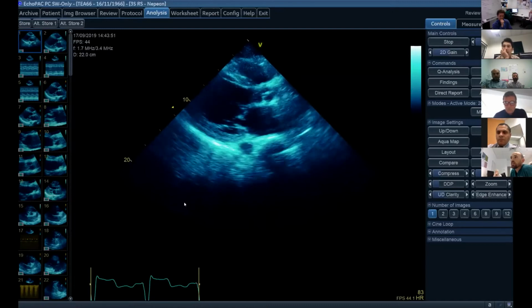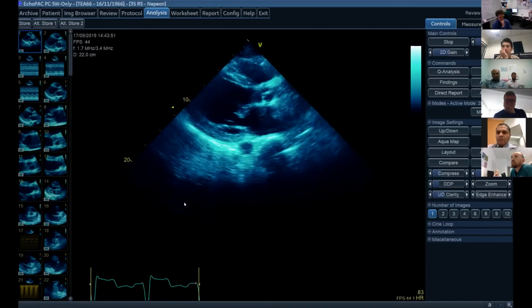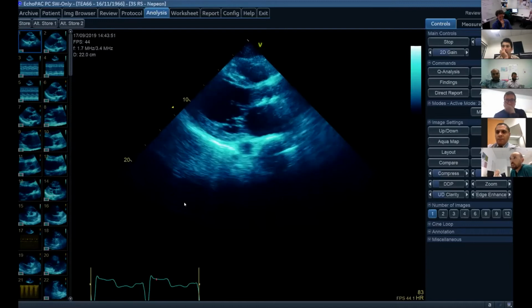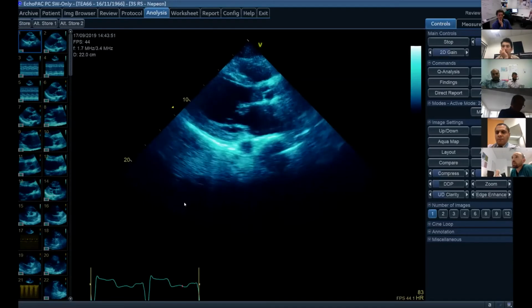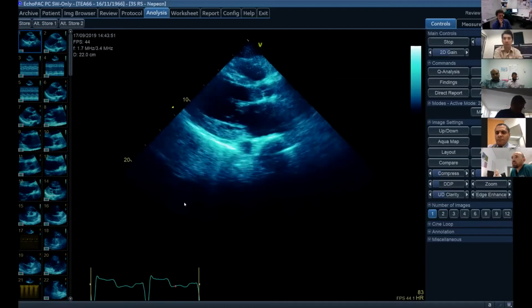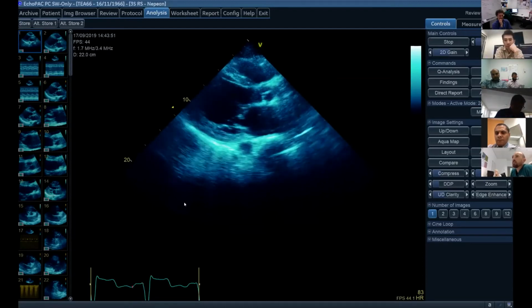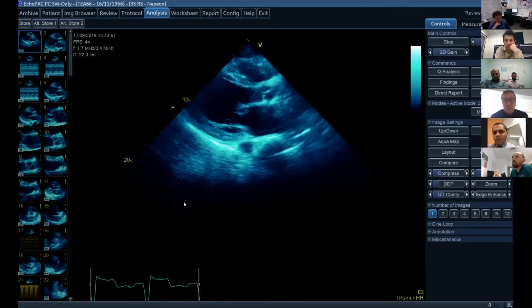Cardiothoracics didn't feel that he needed an emergent bypass, in that his vasopressor requirement was not that high. And they wanted some stabilization before they thought about transferring, and there were some bed availability issues. So he came to the unit, intubated on FiO2 of 30%, PEEP of 5, on a low-dose Aramine infusion, and I performed this echo.